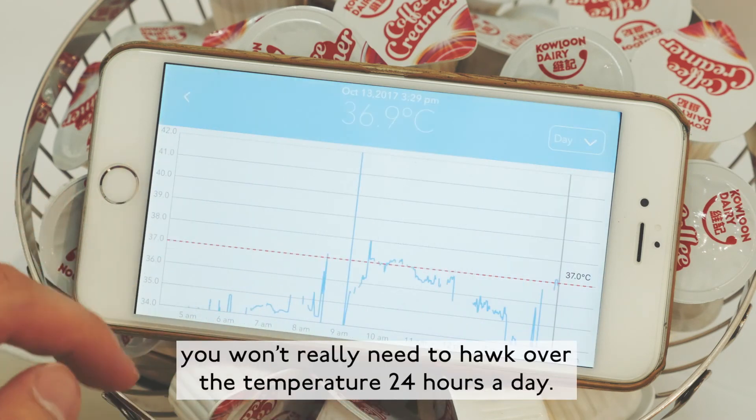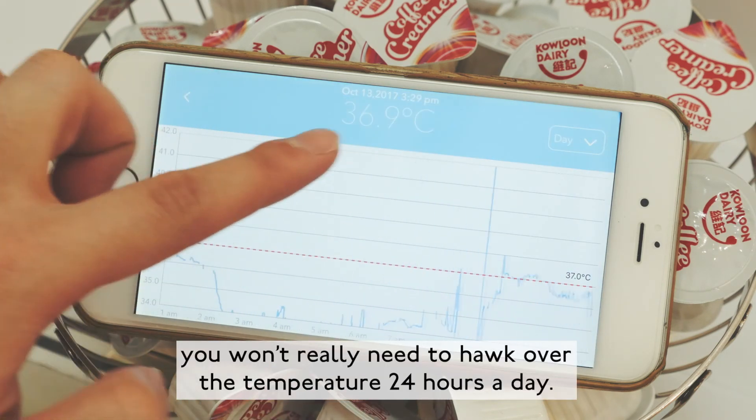But in most cases, you won't need to hunch over the temperature readings 24 hours a day.